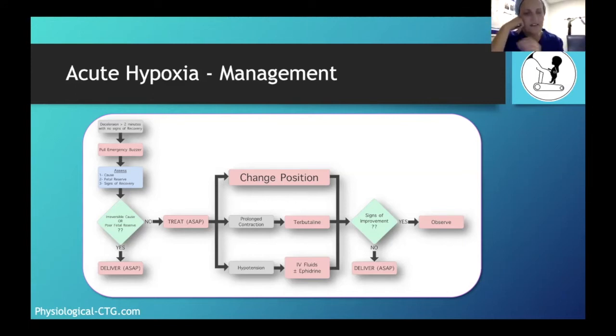I think it's very important to look at the variability. But when there is this ischemia, I don't think that we can say directly from the variability. That's how it works beyond our eyes, for acute hypoxias.